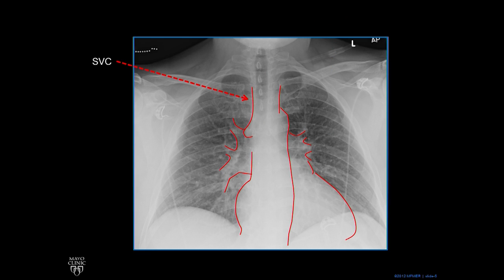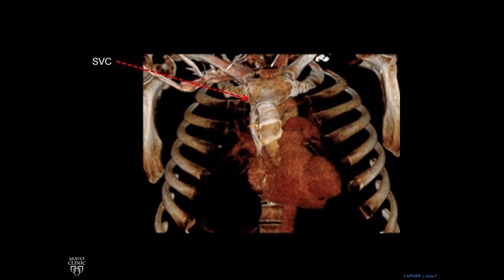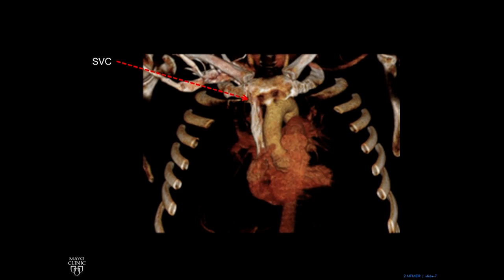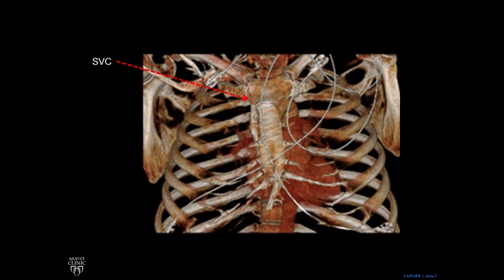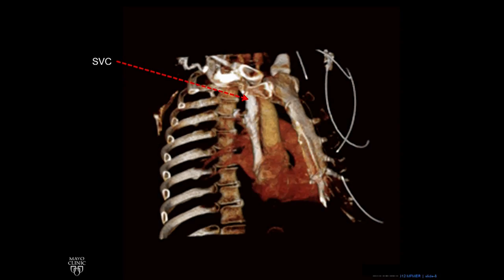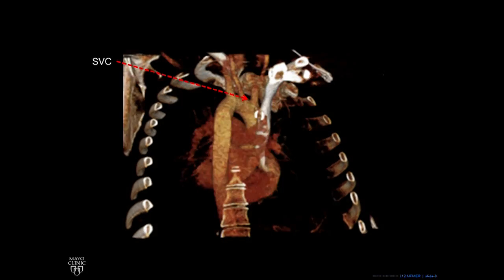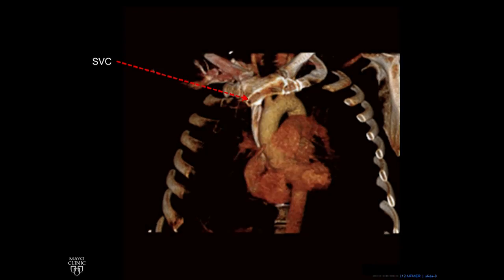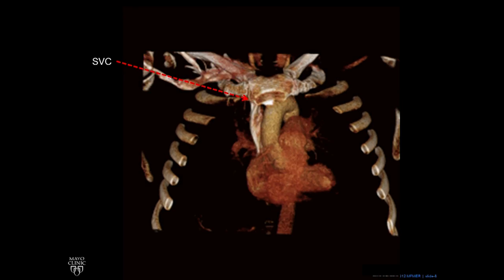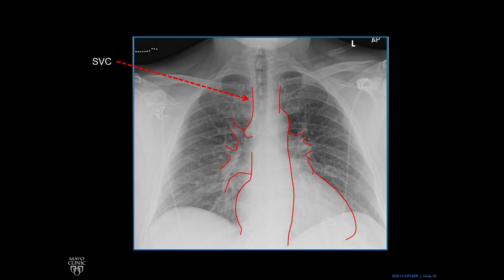Here's our chest x-ray, and then we're going to fade it out. We overlay a CT scan — a 3D volume rendered CT scan from the same patient — and you can see that that line really is the superior vena cava. It drains down into the right atrium. We rotate it around, and you can see the superior vena cava draining into the right atrium. We spin around from the back, and you can also see this little vessel draining into the SVC from the back, which we'll get back to.